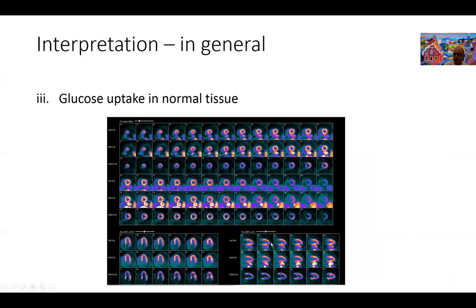Then you have the issue of glucose uptake in normal tissue. Normal tissue utilizes glucose. This is a patient with a completely normal heart, normal rest and stress images. They did not check these images before the patient went on to the FDG. You can see in this patient you have physiologic heterogeneity in FDG uptake.